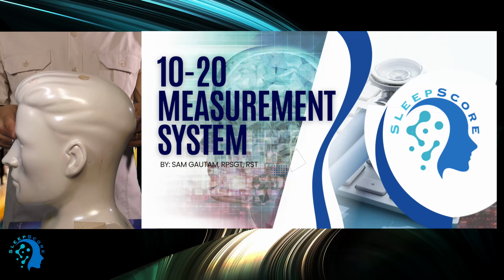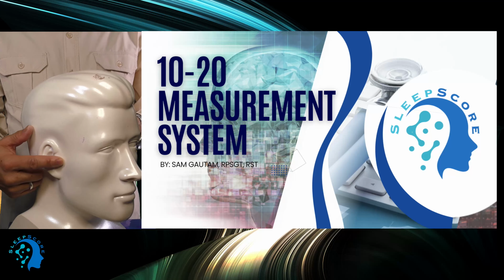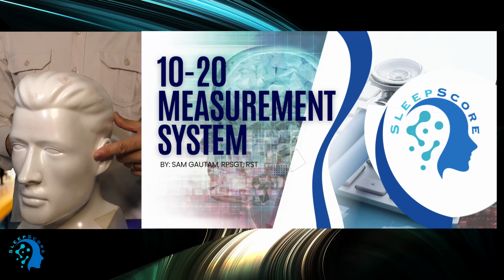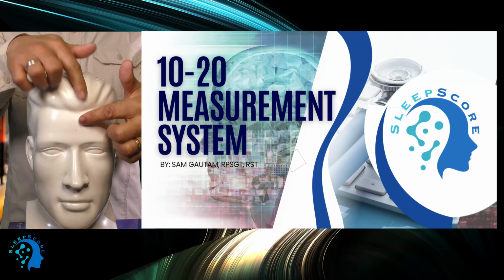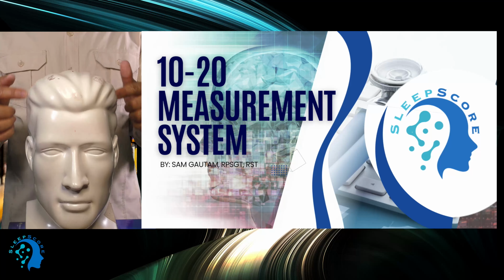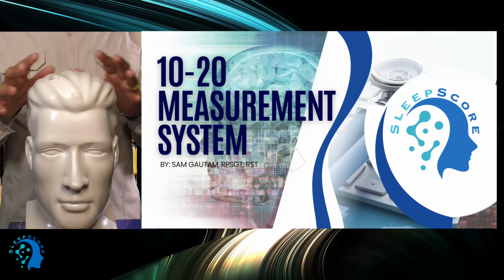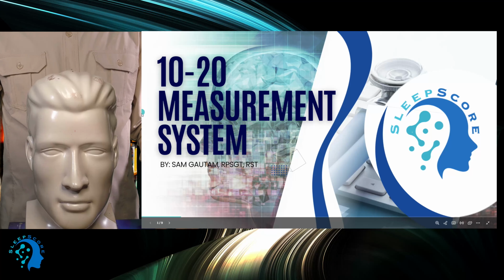And the same way, from here, this is called preauricular, this little indent. From here to the other side, this is called preauricular. So we have to measure this side. So one is like this and one is like this. And from here we have to do the 10-20 measurement system.